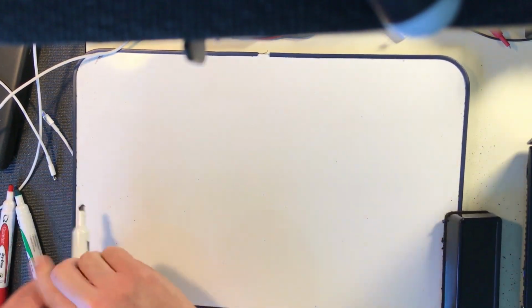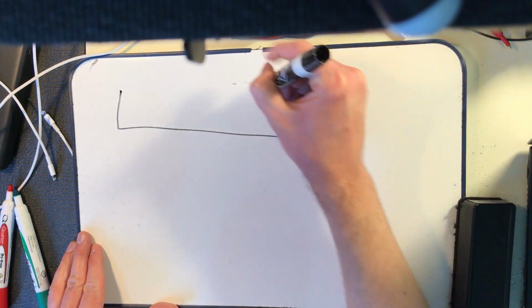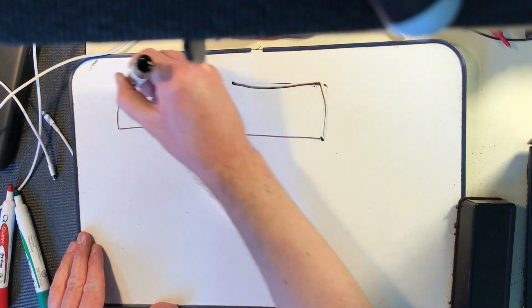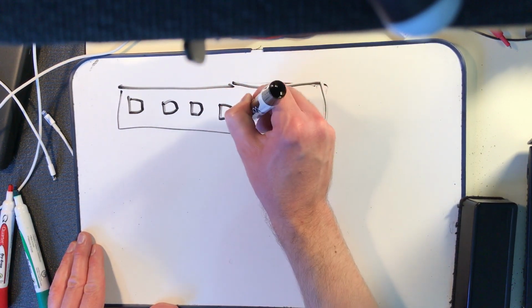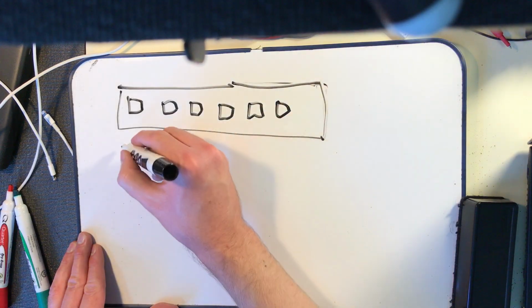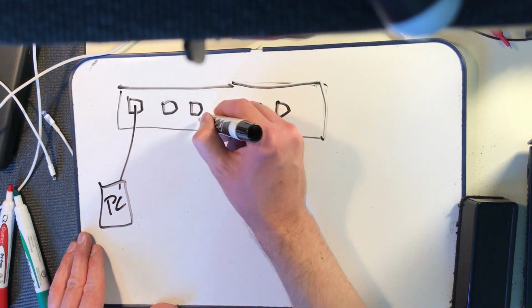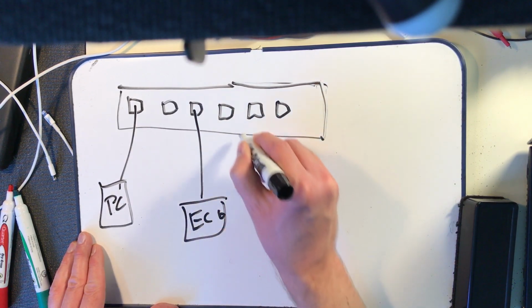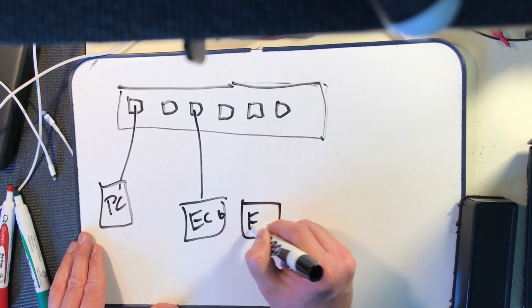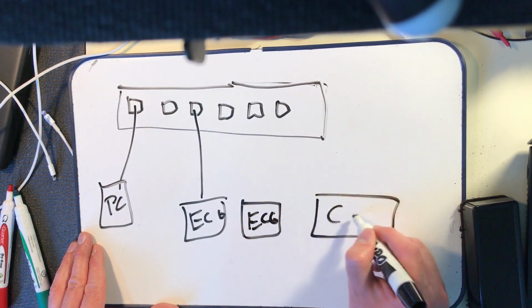Same thing as before, have our switch, which connects to our PC, have our ECGs, and our central station.